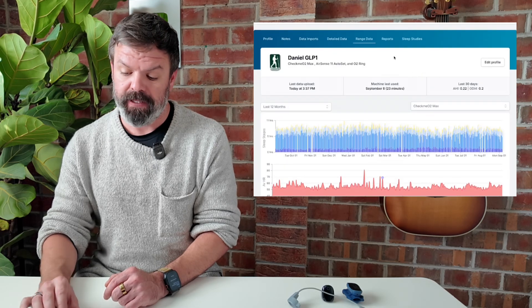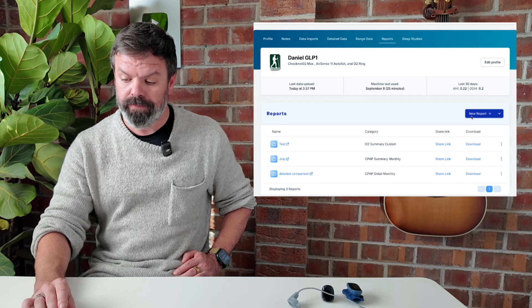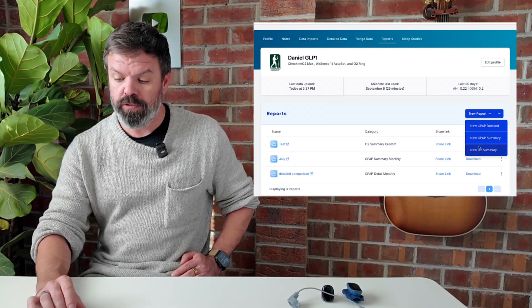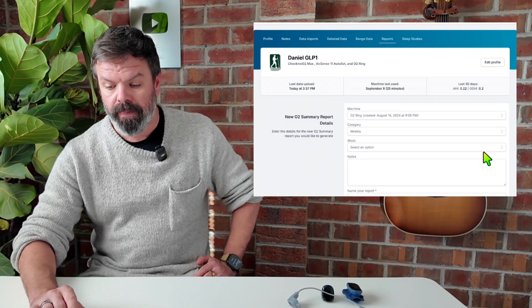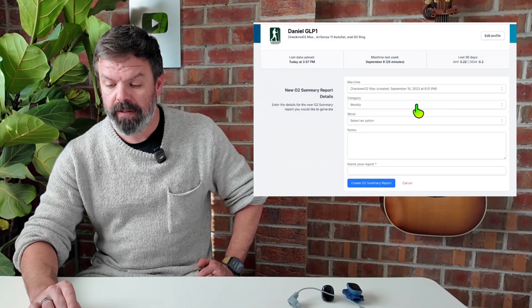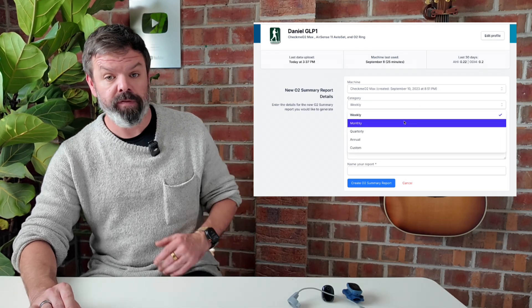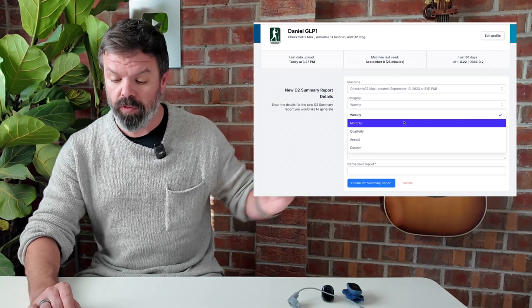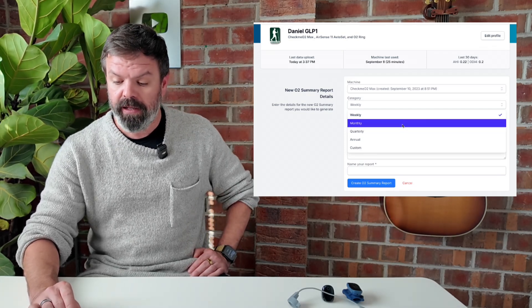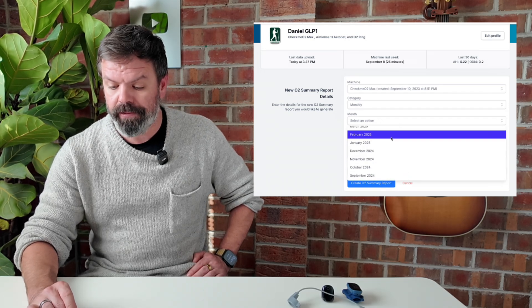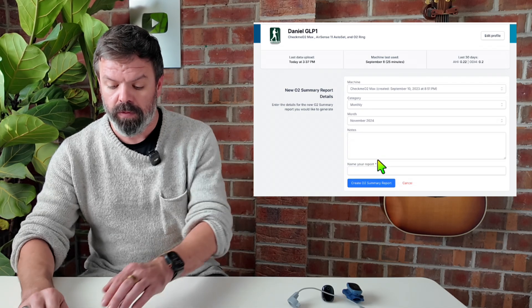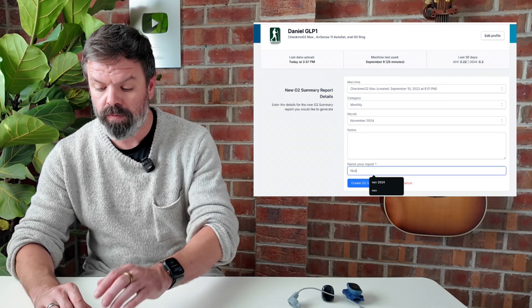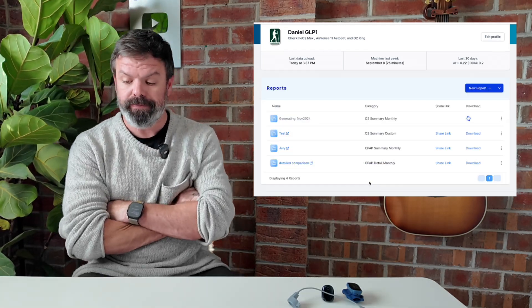So I'll come up here and we'll go report and we'll go new report, new O2 summary. This is the new one here. And we're going to choose our ring. He's using the Check Me. We're going to do category monthly. So there's a lot of options here for you. You can do a quarterly report. You can do an annual report, custom report, whatever you like. You got the options there. We're just going to do a monthly and we'll select the month of, let's go, we'll go November. And we'll call this November 2024. Click generate O2 report.